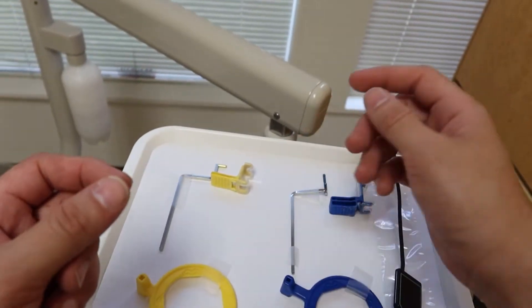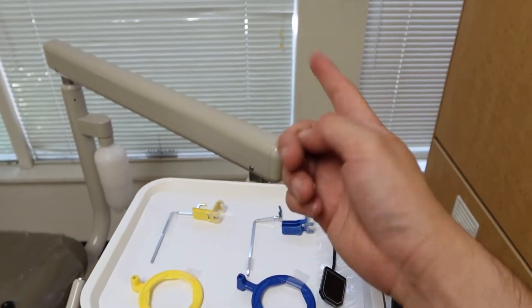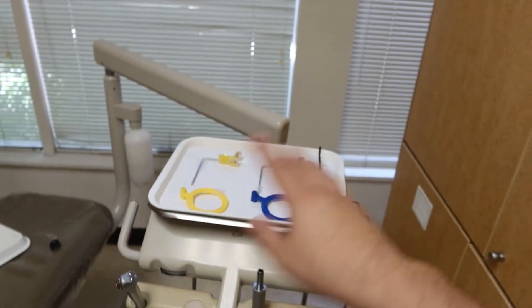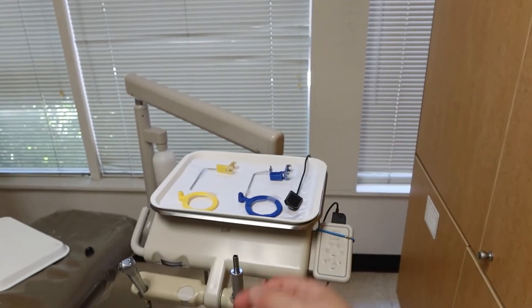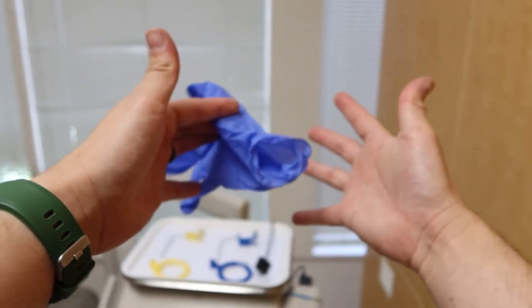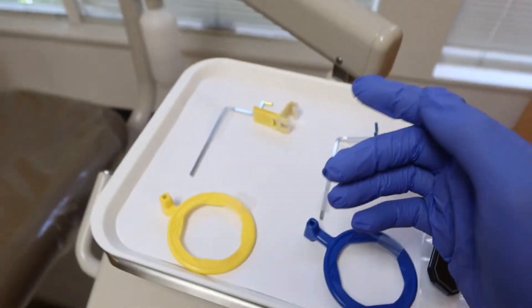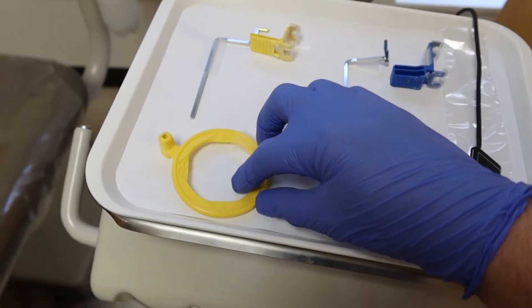Before I go and touch them, remember our golden rule: we need to glove up every time before we work with anything that's gonna be used on the patient. So let's always be ready with your gloves. One, two, three — awesome. Now that we got our gloves on, let's go ahead and look at our whole equipment here.